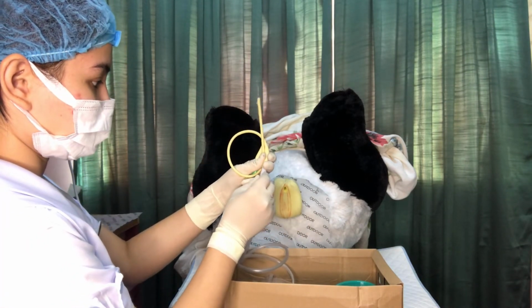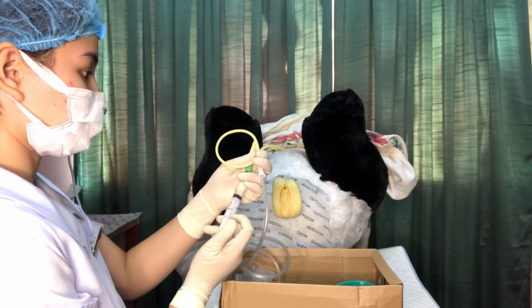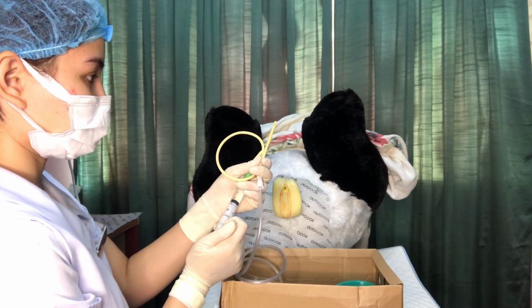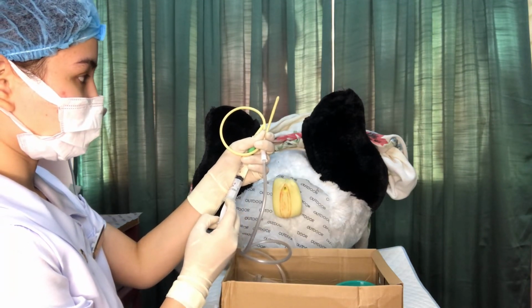There I will also connect the drainage bag. So make sure the Foley catheter will inflate, and that we can also aspirate it back.